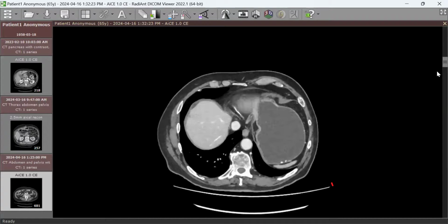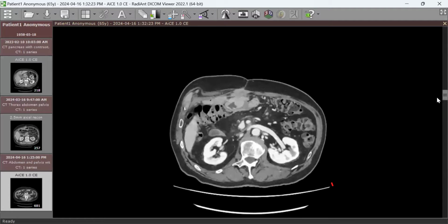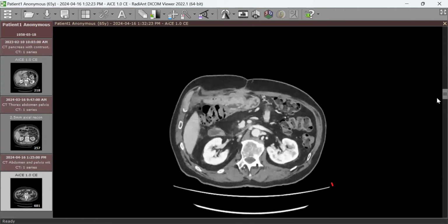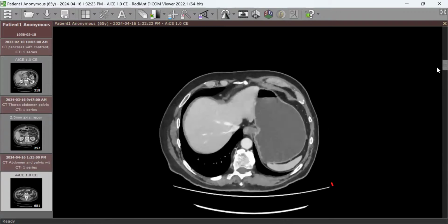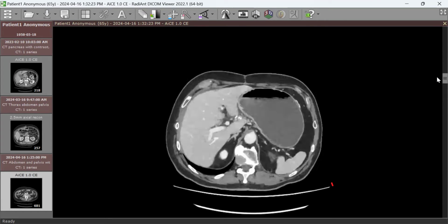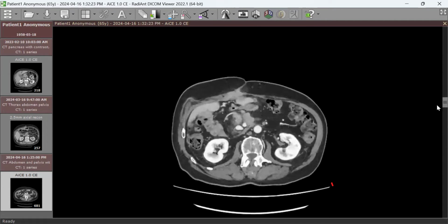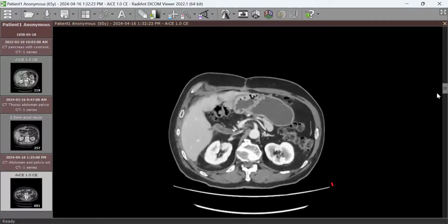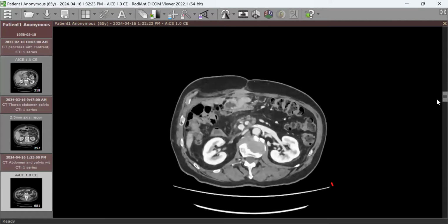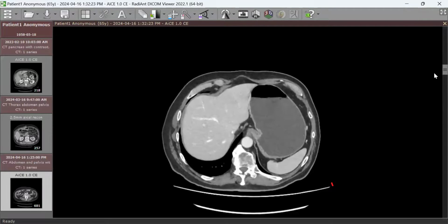Look, if you look at other organs, have a quick scan, see if the other organs are missing. The liver looks normal. Okay. Spleen. Yeah. So I'll tell you, there is no second part of duodenum, not even the first part, actually. And there's no third part of duodenum. There's no gallbladder. And history of surgery?